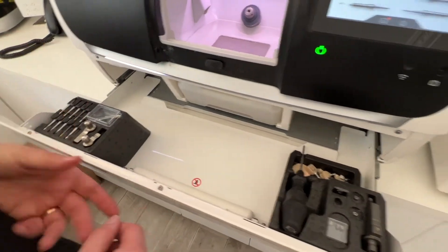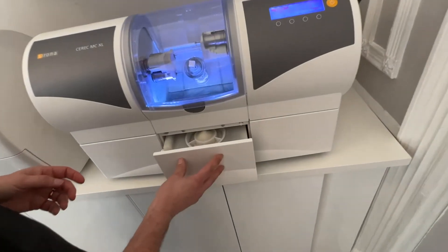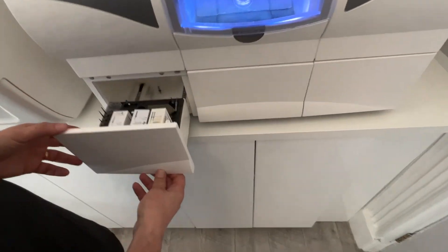Moving across to the MCXL, it's a slightly different setup. Here the tank sits separately and then we have the drawers on the side instead.